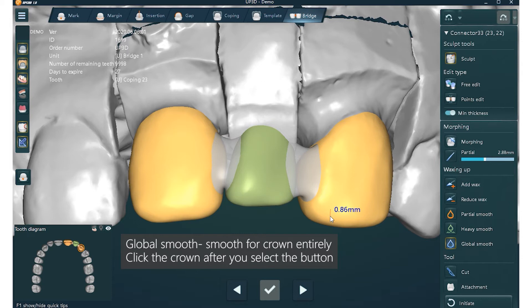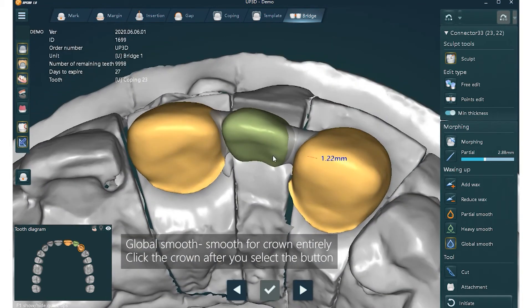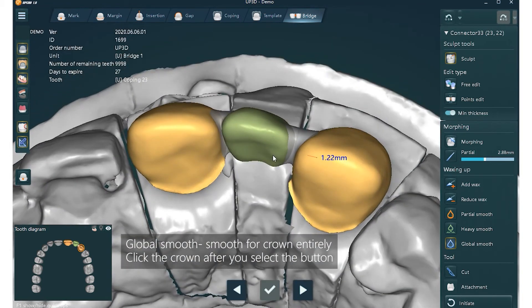Global Smooth: smooth the crown entirely. Click the crown after you select the button.